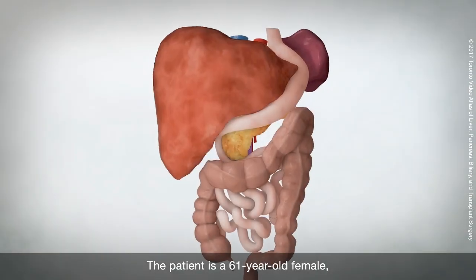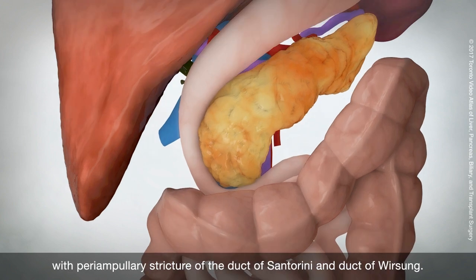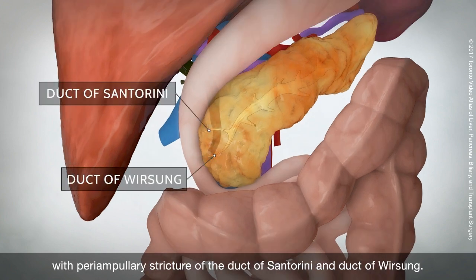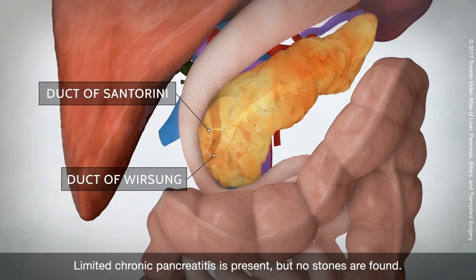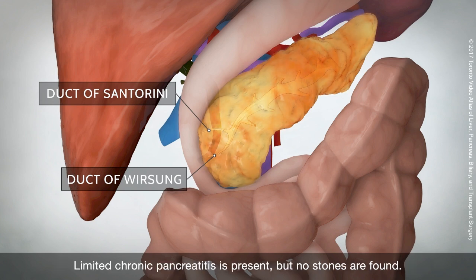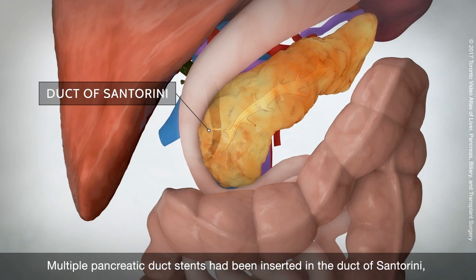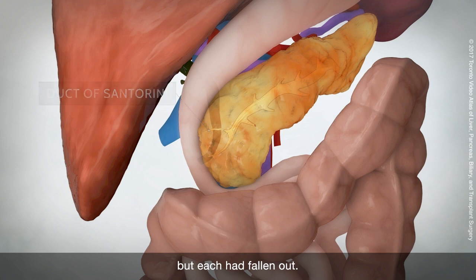The patient is a 61-year-old female with periampullary stricture of the duct of Santorini and duct of Wirsung. Limited chronic pancreatitis is present, but no stones are found. Multiple pancreatic duct stents had been inserted in the duct of Santorini, but each had fallen out.